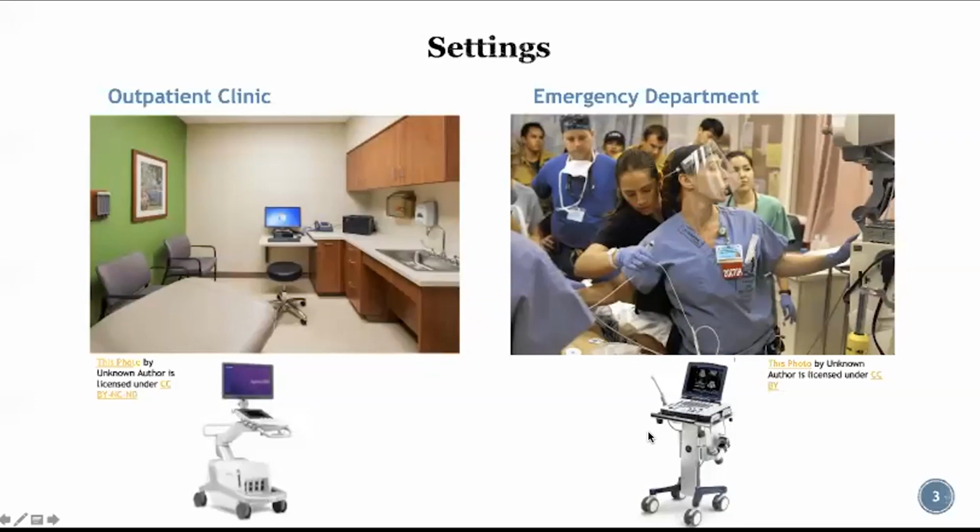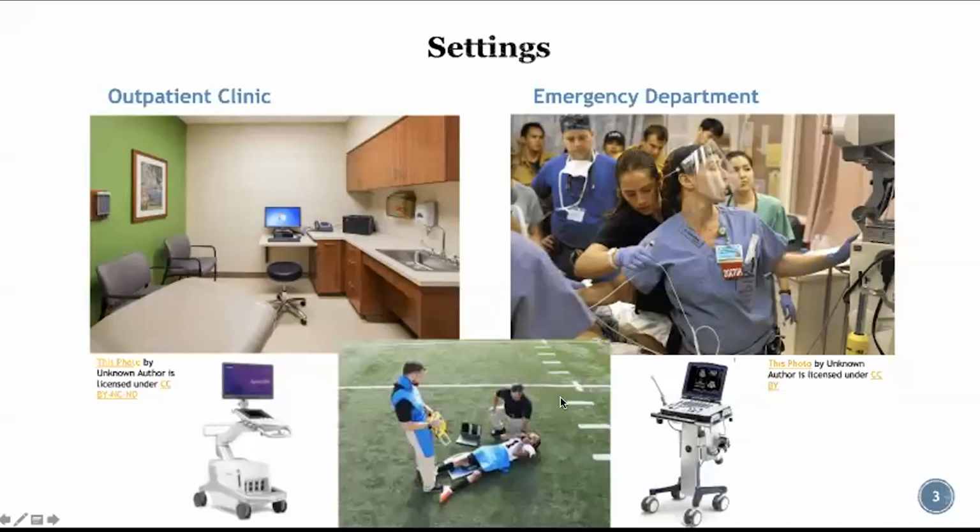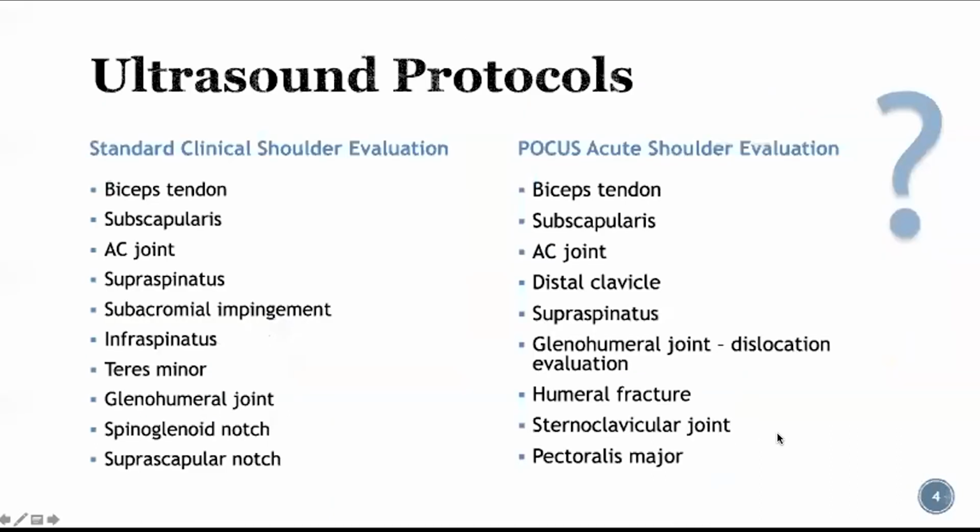So first of all, the setting that I work in on a daily basis is a controlled environment outpatient clinic where we often do a pretty complete ultrasound. And most of you in the ED are reaching over a lot of people, managing lines, and you're pulling the ultrasound in for a really quick point of care look. When I'm on the sidelines, I'm doing a little bit more of what you're doing, where you have a question to answer quickly in a short amount of time. So that's what we're going to try to cover today.